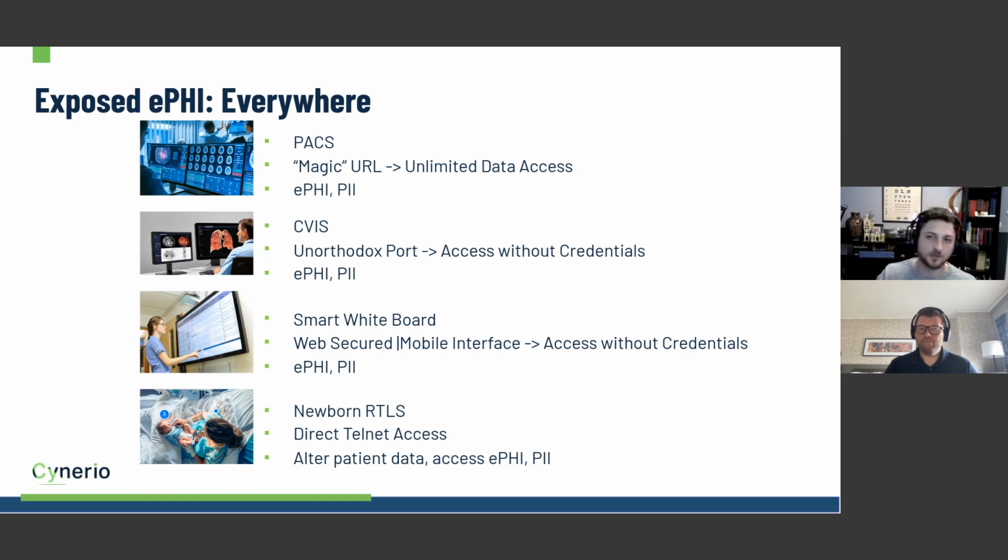So this is the oldest and most basic way to interact on a sort of management or administrative level with a device, right? Just literally go into an old school port interface and tell the device what to do. So in this instance, you could directly edit the database of which wristbands are attached to which babies. You could delete the entire database if you wanted. You can reconfigure it with new information. You could actually slap a user password on there of your own devising, so you're the only one who could know at any given time where all these babies are, and not release the information.